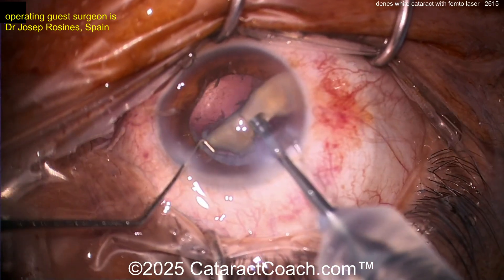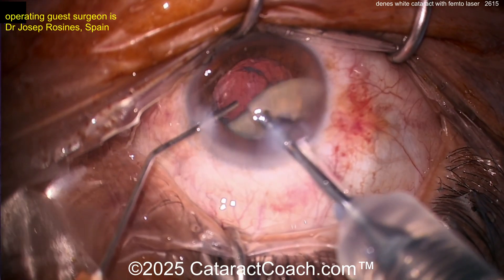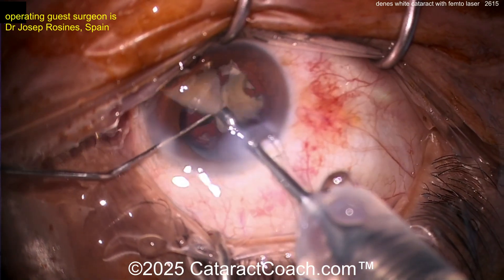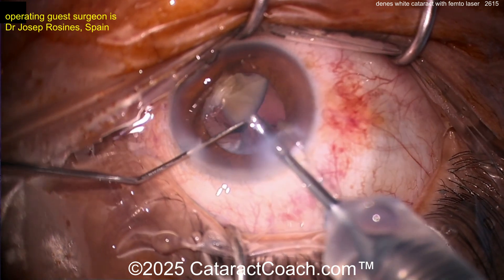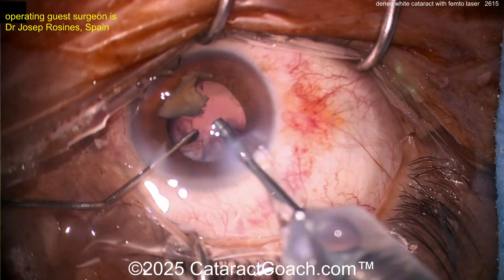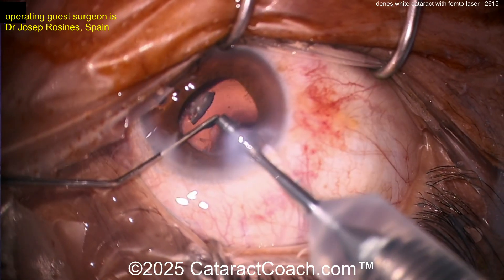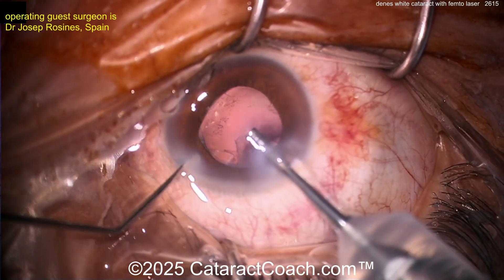It's truly a miracle — this patient walked into the clinic blind and will leave with great vision. Even more viscoelastic — another smart move, really protecting that posterior capsule. Remember, nothing is weighing down the capsular bag, so the viscoelastic will keep the posterior capsule away from the phaco tip. There's the last piece coming out, chopper in the safe position — get that last piece out. Boom, very nicely done.